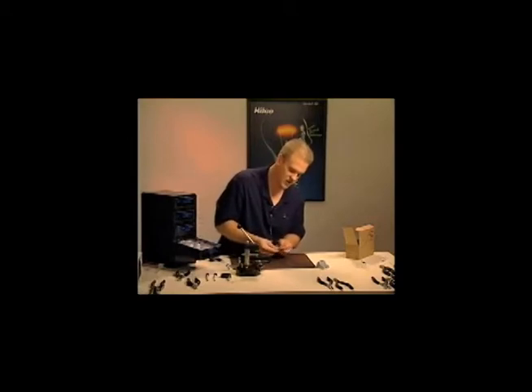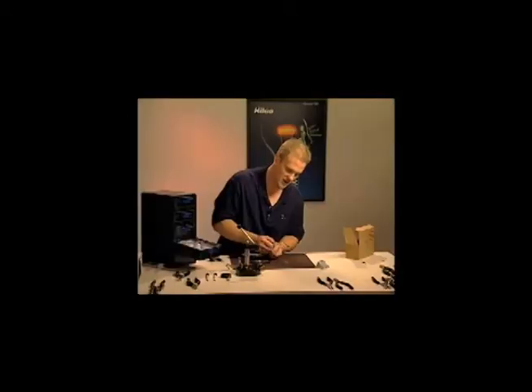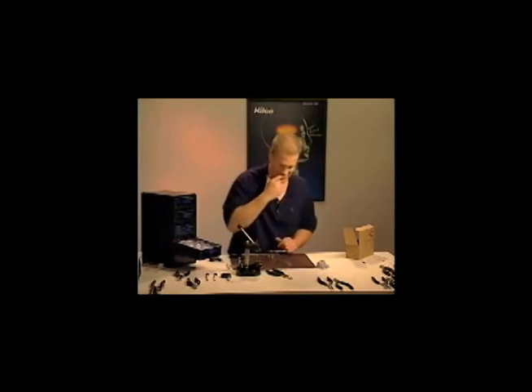The customer will never know that that's a repair screw, and it looks much better than the old nut and bolt repair where you put a lens screw through and then a nut and sock it home, especially on expensive frames. Usually doing that to a real expensive frame is not going to make your customer all that happy.